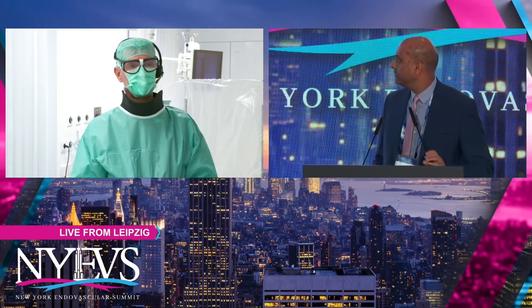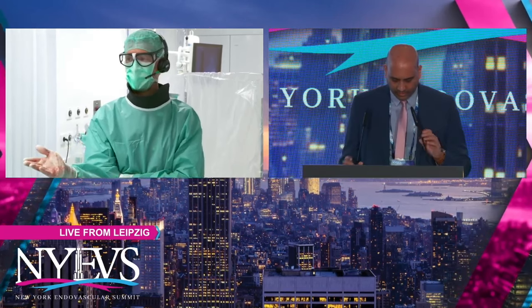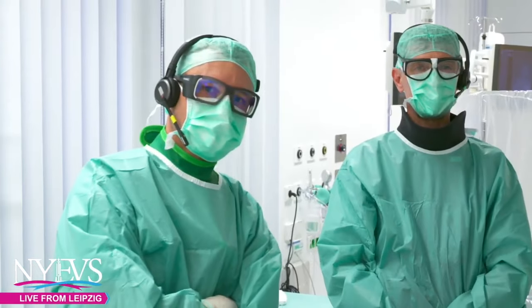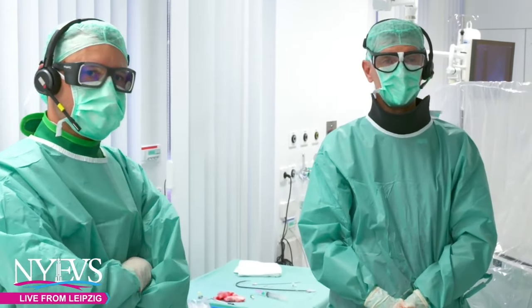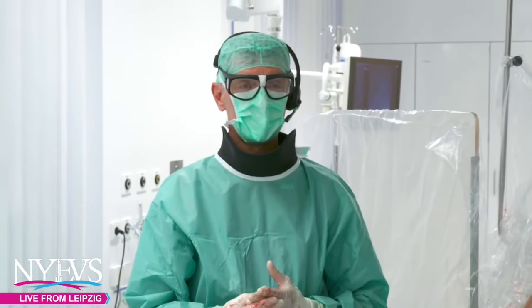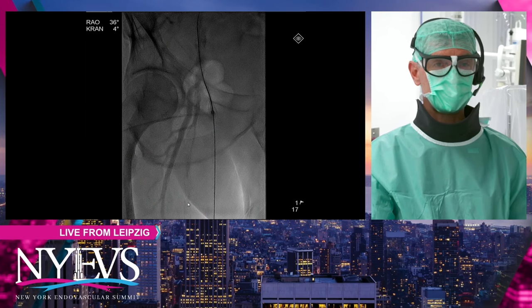Thank you. If you want me to start, I can do this. Yes, please, tell us what's happening. With me is Marion Czupek. He's one of our interventionists here in the cath lab. If you can show me the slides. The slides, please. Second case, please.